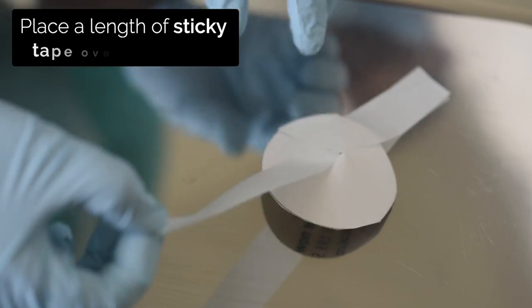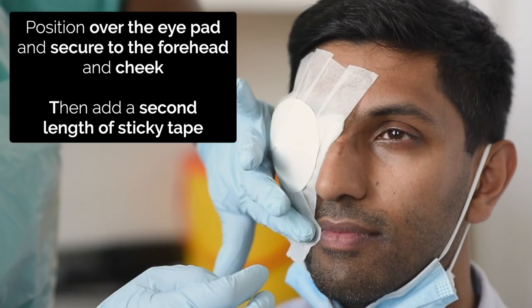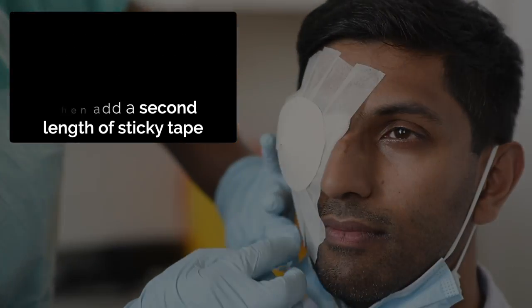Finally, place a length of sticky tape over the shield. Position over the eye pad and secure to the forehead, then cheek. Add a second length of sticky tape.